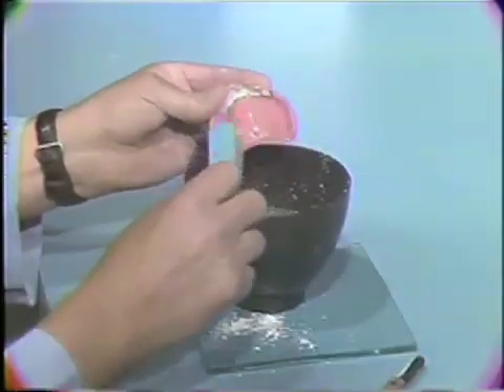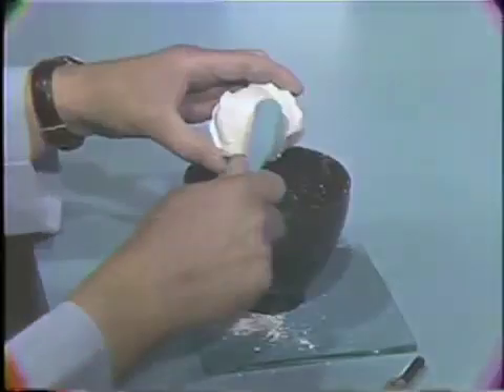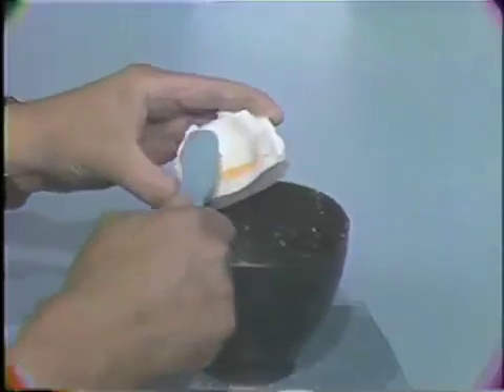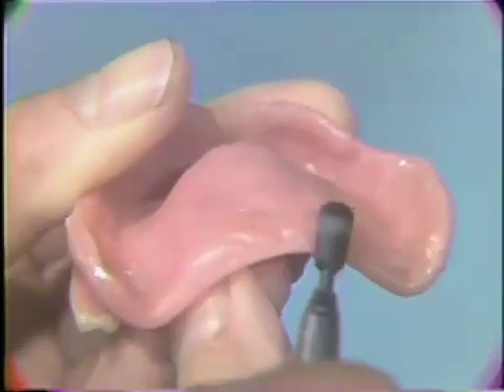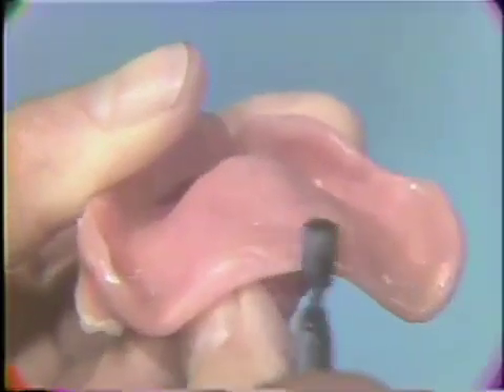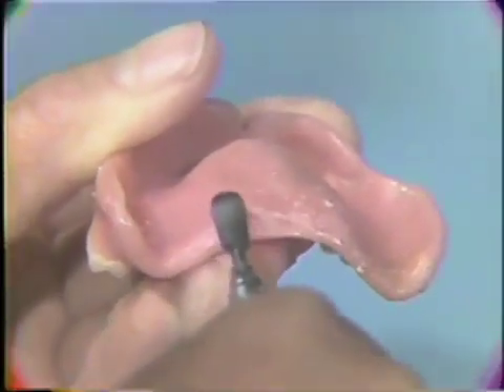Then, scrub with a brush and detergent to remove all wax from the impression plaster cast and from the denture surface. Use an acrylic burr to freshen the posterior palatal seal site by grinding the internal surface of the maxillary denture.